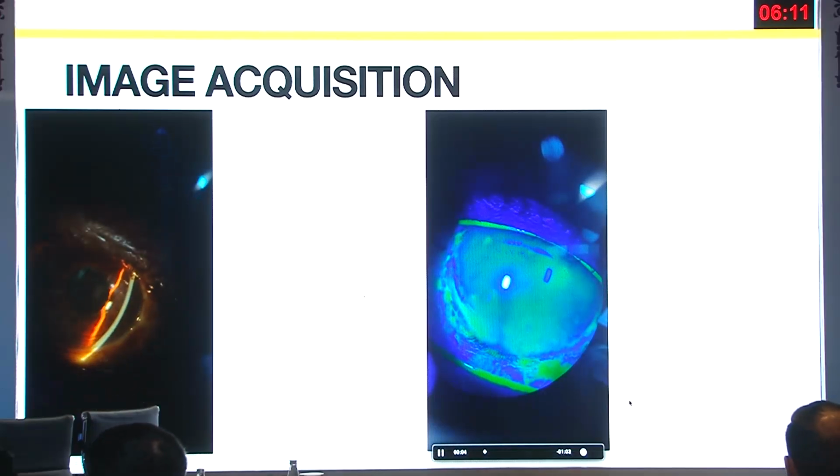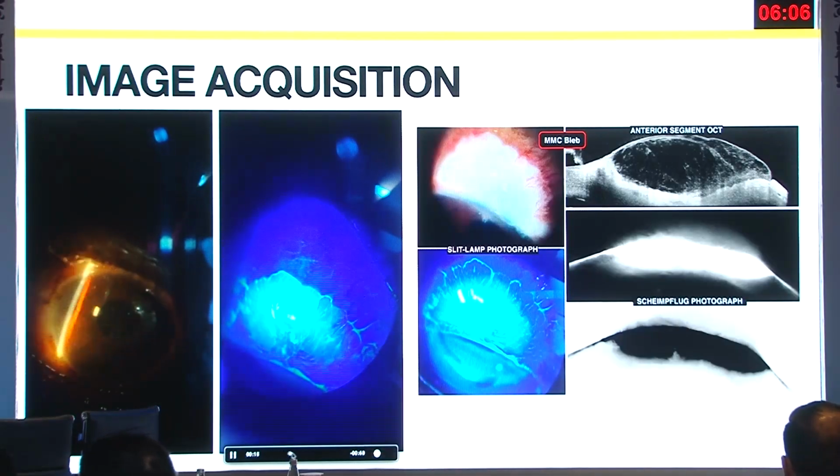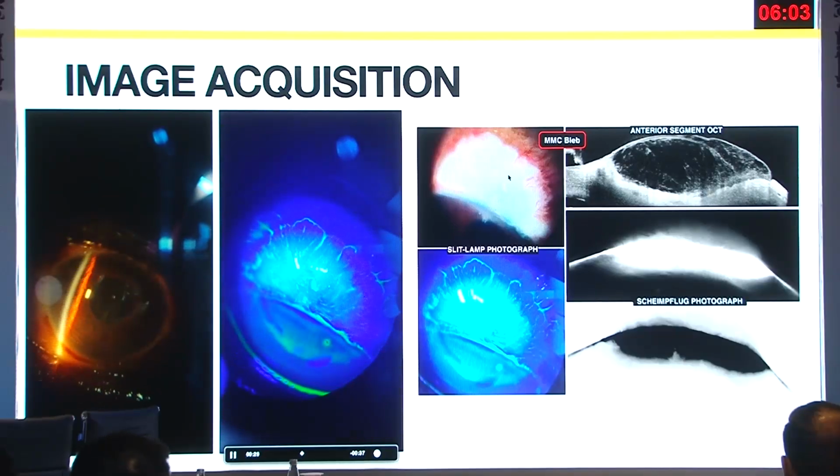Any imaging that we do, we make sure it's part of multimodal. Anterior segment along with the bleb of the same patient, we make sure we have assorted multimodal imaging.